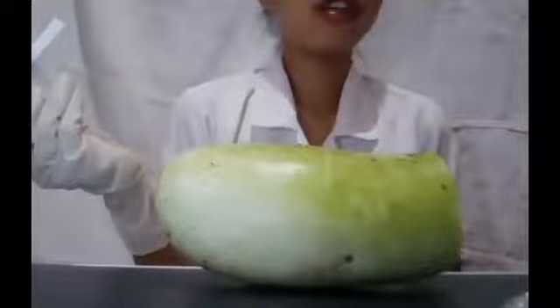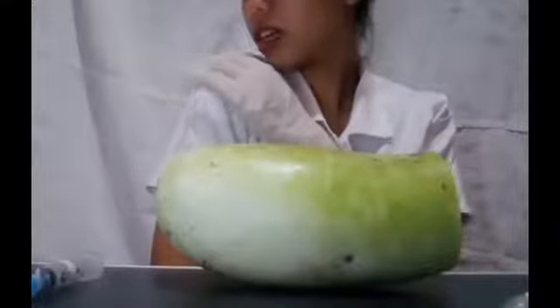So there you go. So to do an intramuscular injection on an adult, you're usually going to use the deltoid, and to find the right location, you're going to locate the acromion process, which is the bony part right here, and then you're going to go 2 fingers down, so about right here, and that's where we're going to give the injection.